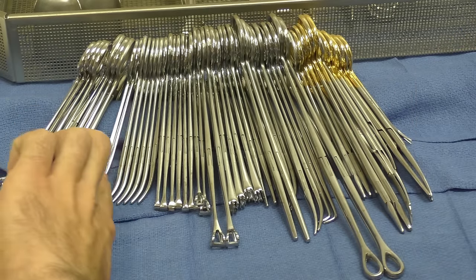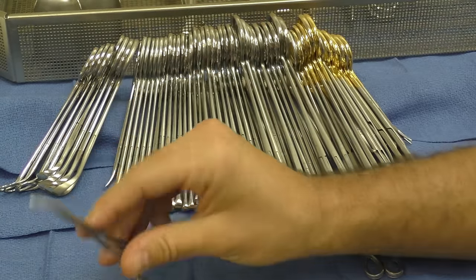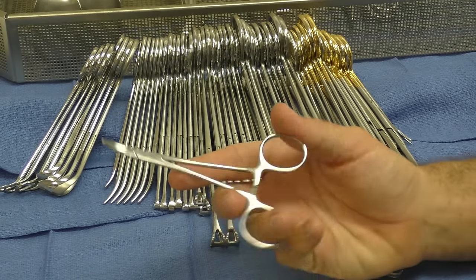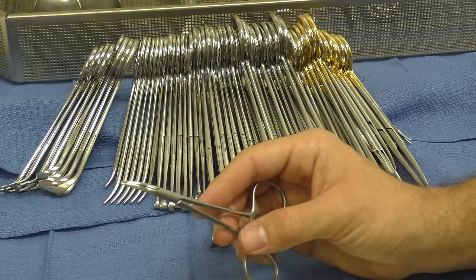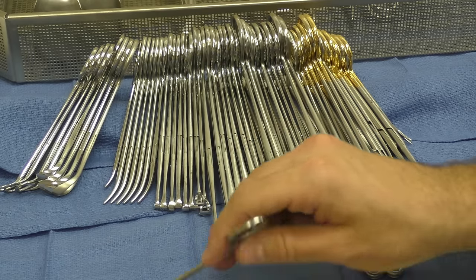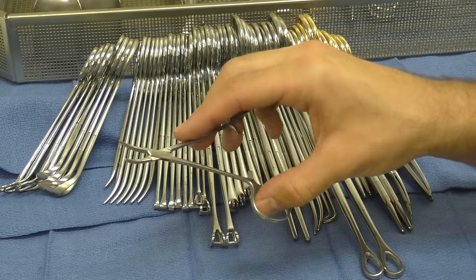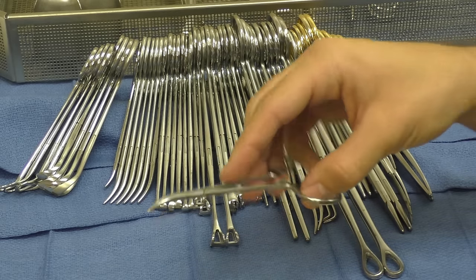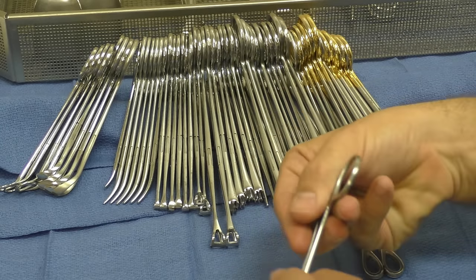Moving along, we've got some mosquitoes here. These are the Halsted mosquito, the proper name for them. Some other names for this might be just mosquito, or other times, just a small clamp. They may use it to clamp off a vascular structure so they could tie around it. Or other times, it may be used to dissect. Instead of using a scissor, they may want to just do blunt dissection, and they'll be able to dissect with a mosquito instead.